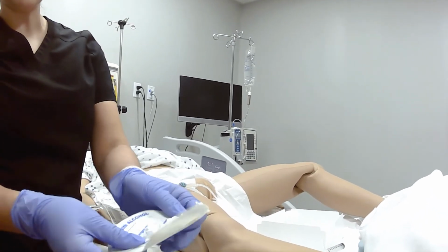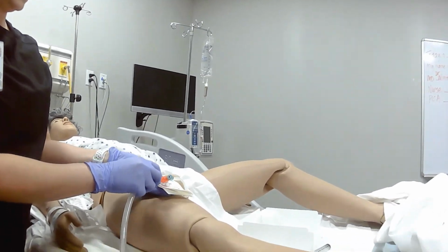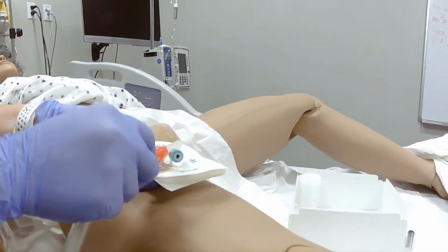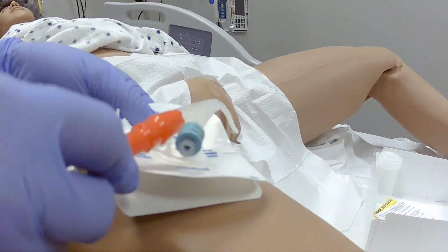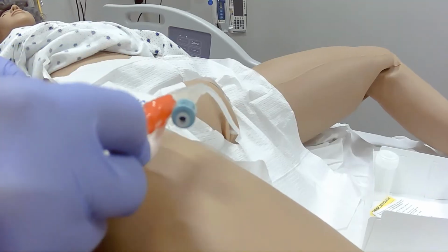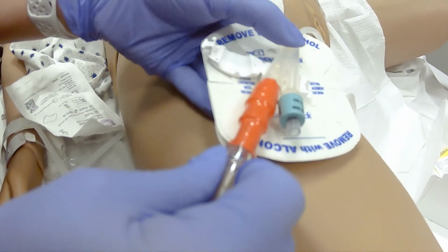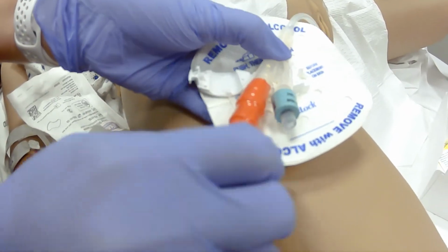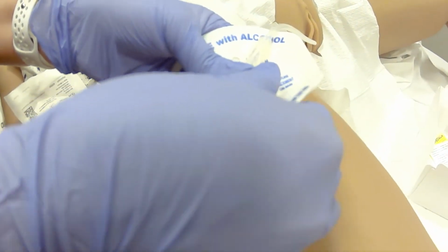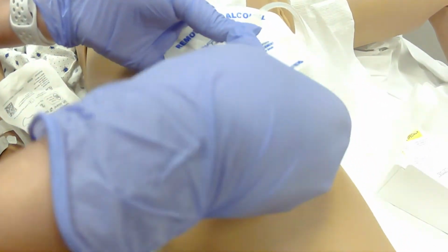So this specific stat lock is going to clip onto the Y ports here. Let me double check. Okay, should be okay. So it looks like a Y, and it'll clip on like so. Just make sure that you're not tugging on it too hard, because then it's going to cause injury to the patient.